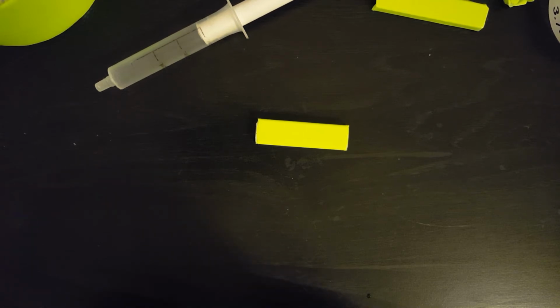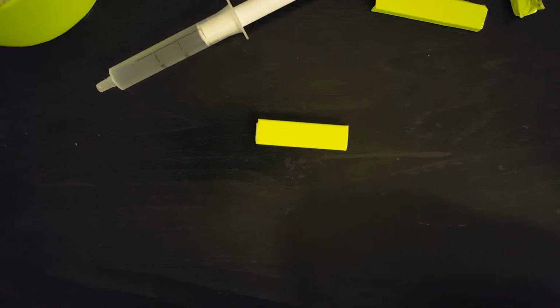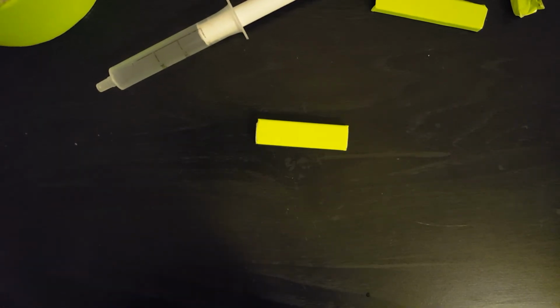And they have syringes ranging from the size I have, although I've seen some up to 30 milliliters, and then they have smaller ones for pets. Whatever the need is, you can get access to whatever you need, okay? And so I don't want parents or anyone to feel like they can't give children their medication through a syringe even though they're a certain age, okay?